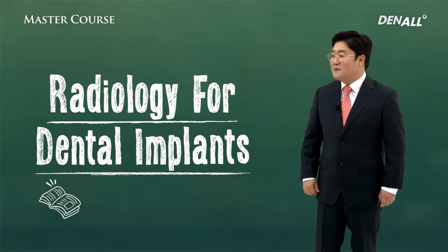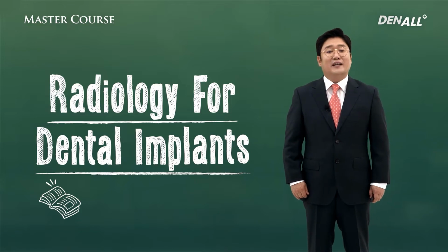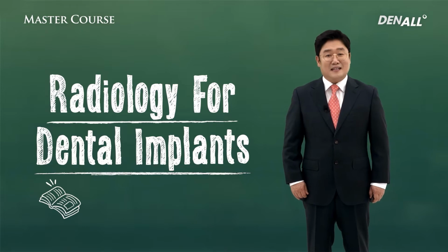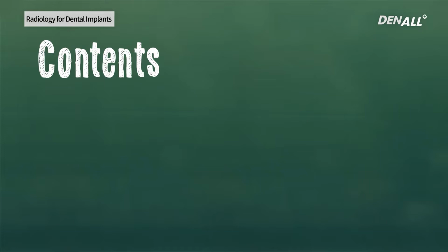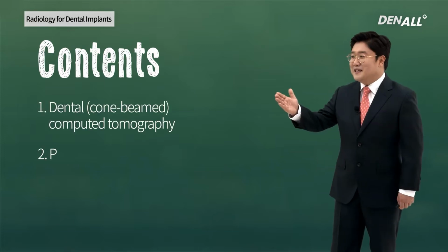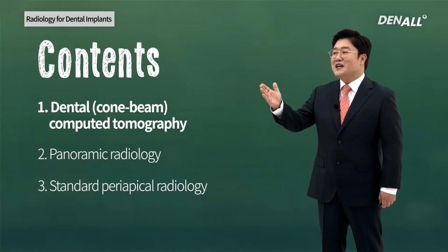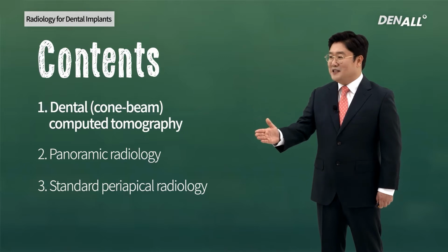Today, I will be presenting radiology, the basic image taking and interpretation. So let's have a look at the contents first. 1. Dental computed tomography or cone beam computed tomography. 2.